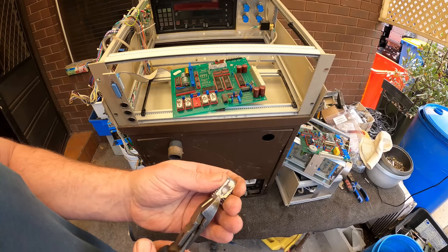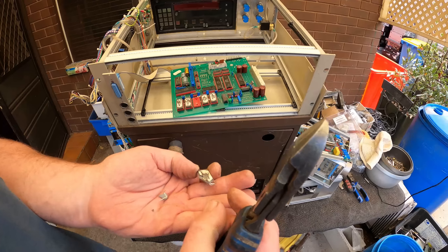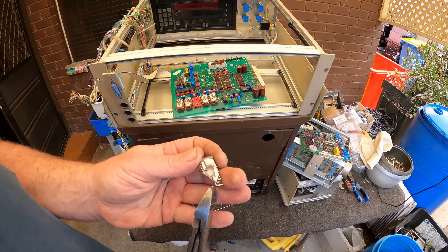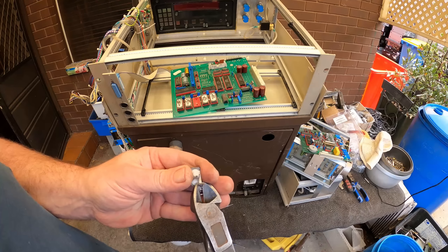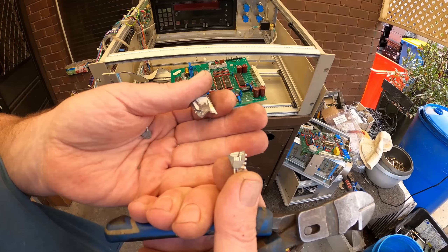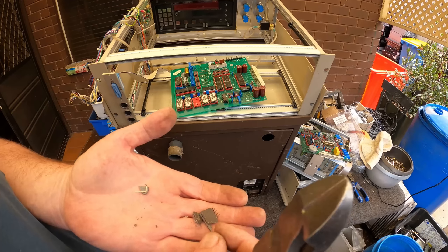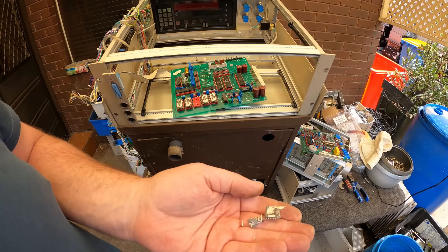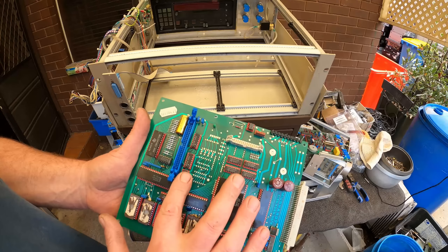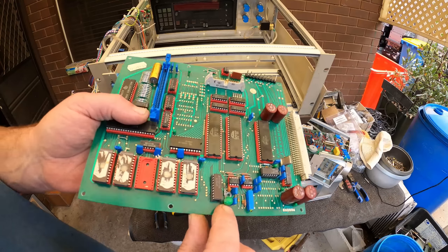I might just see if I can crack into this a little bit and see if we've got any gold bonding wires or anything - because if you can't see gold, they don't use white gold. I'm still not 100% whether it's silver or platinum, but definitely there's no gold colouring, so it might be silver. But it also could be something else - I'd like to get these analysed. They're all removable ICs so that's what I'll just do - take them off, take the pins, tantalum - these green tantalums. Not bad.